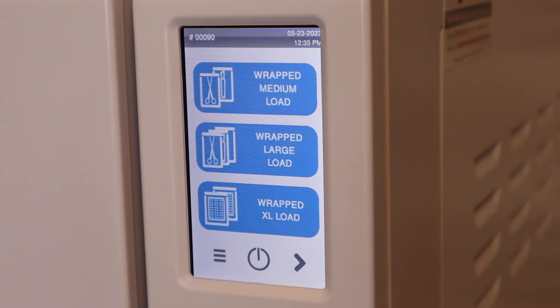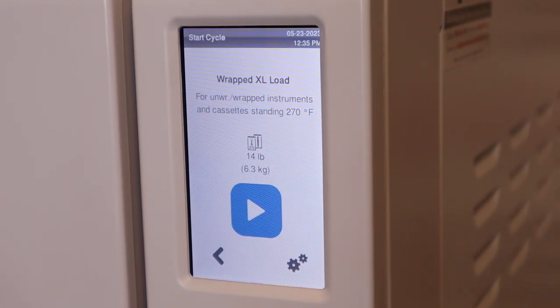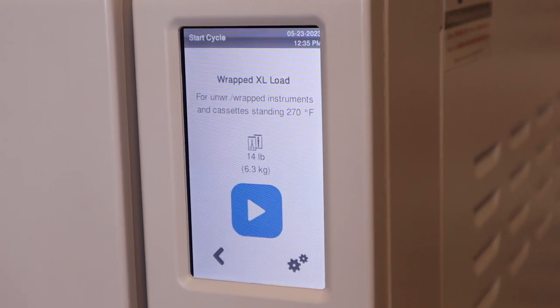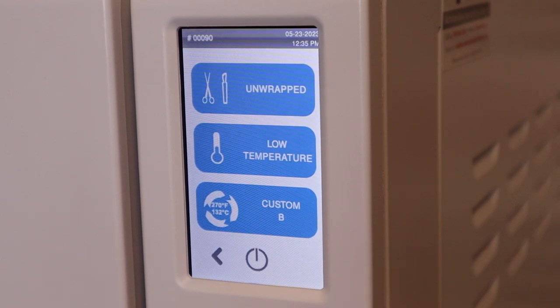For instance, we're going to select the wrapped XL load. It's going to give us our parameters for that load. This load is going to be sterilized at 270 degrees Fahrenheit. The maximum weight for this load is going to be 14 pounds, and these are going to be wrapped instruments. Every cycle selection on this first page is going to be wrapped instruments.